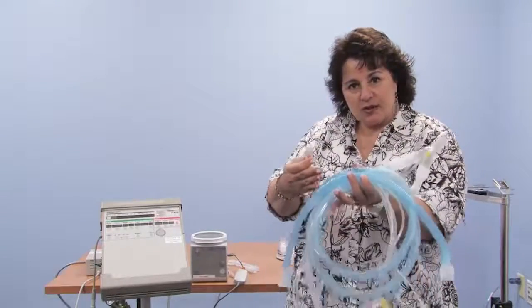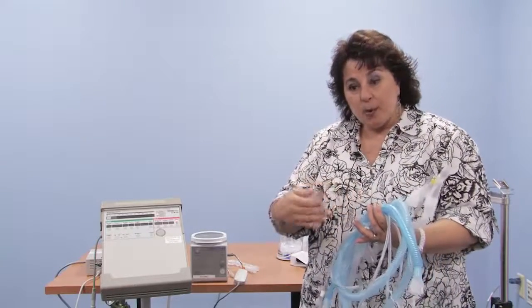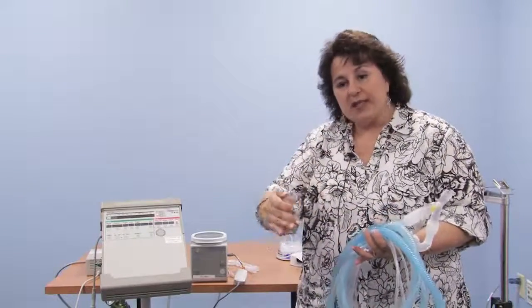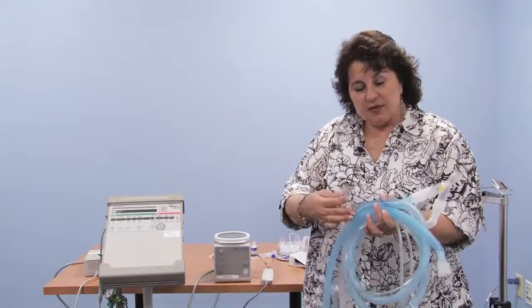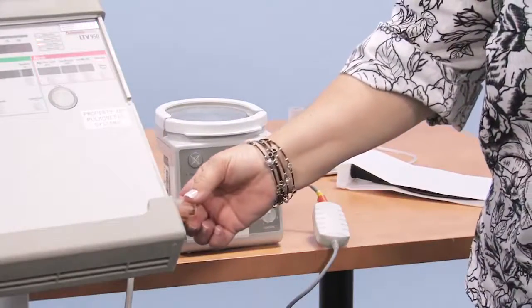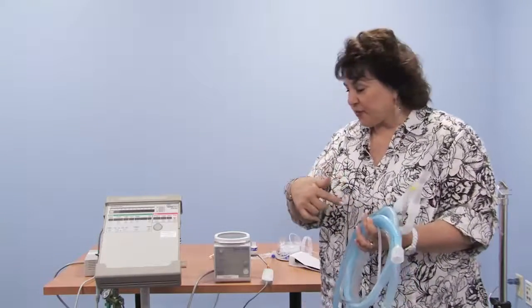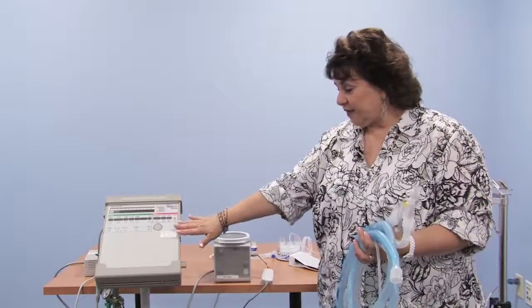So in the package, I've opened up the package for the pediatric heated wire circuit. Some come with the heated wire both on the inhale limb and the expiratory limb. This one is just on the inspiratory limb. That is what we use here in this area and we find is more than adequate. So we have this clear adapter that comes in the circuitry. Be careful it doesn't fall out of the package. This is provided so that you can connect the gas outlet of the machine to the inhale limb of the ventilator circuit.